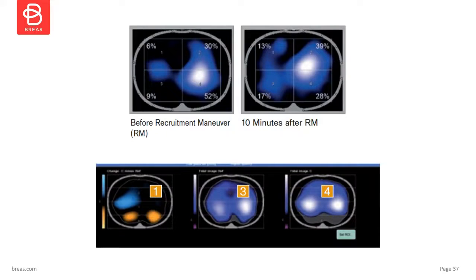But what we found in those groups was that with those repeated insufflations, you did get almost breath by breath recruitment, which is really positive. That's what we're wanting. With a negative pressure breath, you obviously do get gross de-recruitment. And then after a few positive pressure breaths again, you are re-recruiting, but it usually takes around 5 to 6 breaths, more so in that neuromuscular group, to get back to any kind of baseline. So how that's going to be seen in an ICU population, we don't yet know, but that's what we're going to try and have a look at. So fingers crossed.